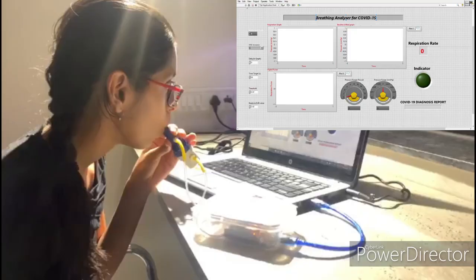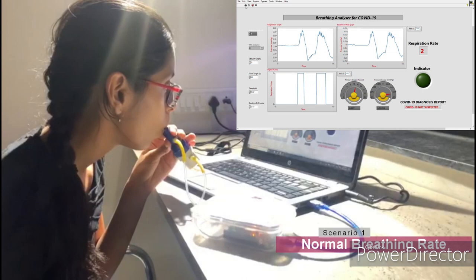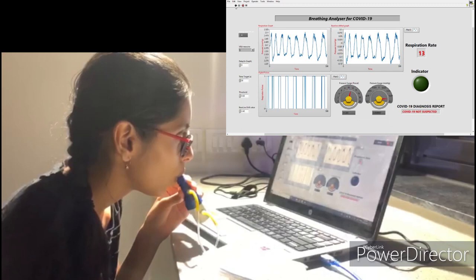Let's check how the device works. To test the prototype, we have two scenarios. In the first scenario, a normal person breathes. The graph displayed on the top corner is actually displayed on a laptop. The GUI contains several parameters as you can see in the top corner.